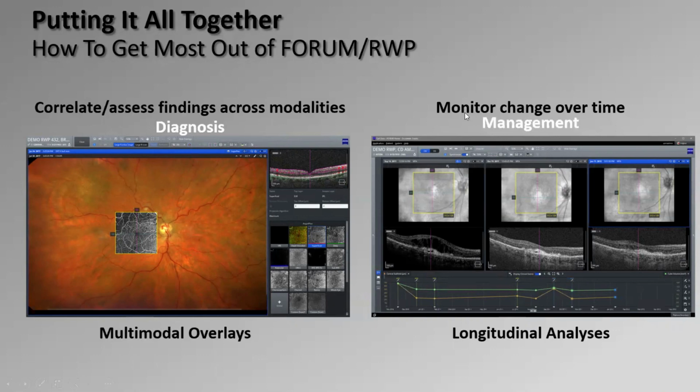And the other aspect we just touched on in the previous slide is these longitudinal analyses, which is where Retina Workplace really comes in. And this helps us monitor change over time. I think this is very helpful for disease management, particularly as it relates to patients undergoing anti-VEGF therapy. So again, look out for these in the live tutorial because we'll be talking about this quite a bit. So why don't we go ahead and move on to our cases next.